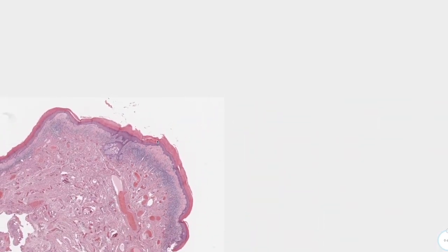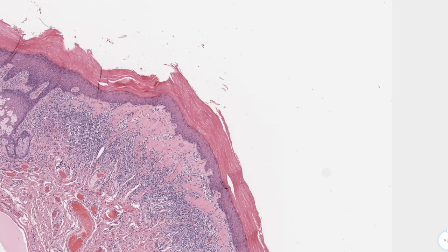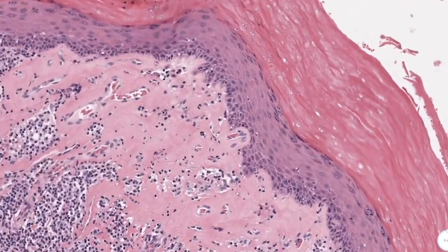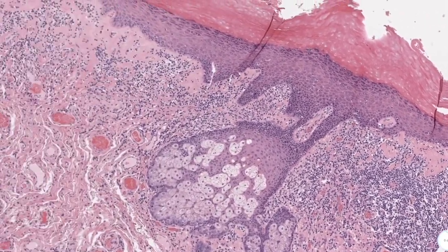What really happens is it starts as interface dermatitis, then moves down and destroys the papillary dermis as well as the upper reticular dermis. As those layers are destroyed and atrophy, the areas get replaced by thick, glassy, homogeneous collagen bundles — seen here as a very pink color — the whole area replaced by collagen after being destroyed by inflammation.